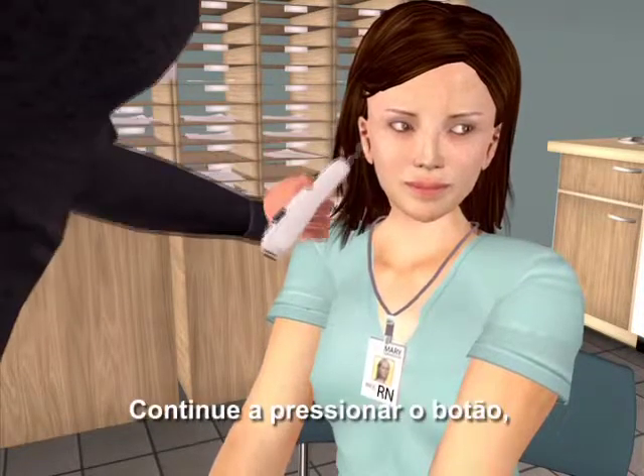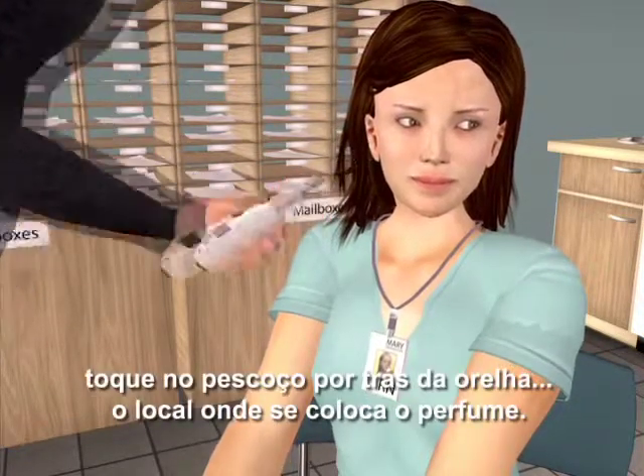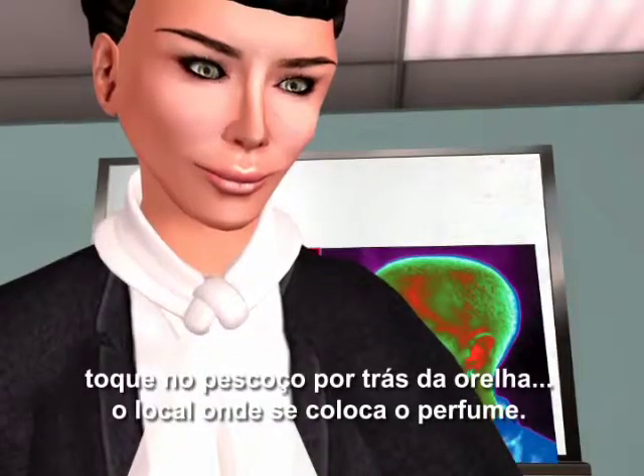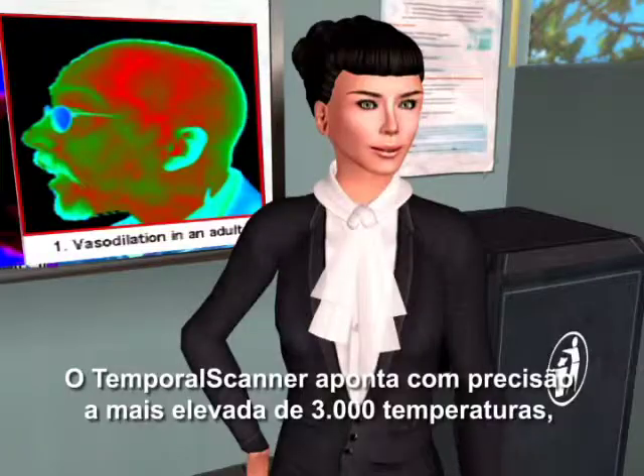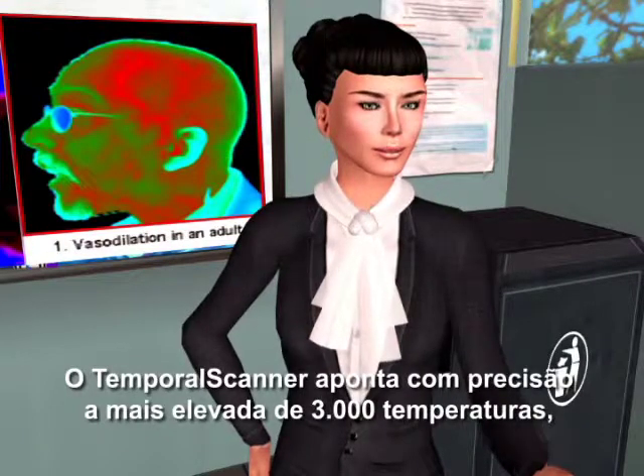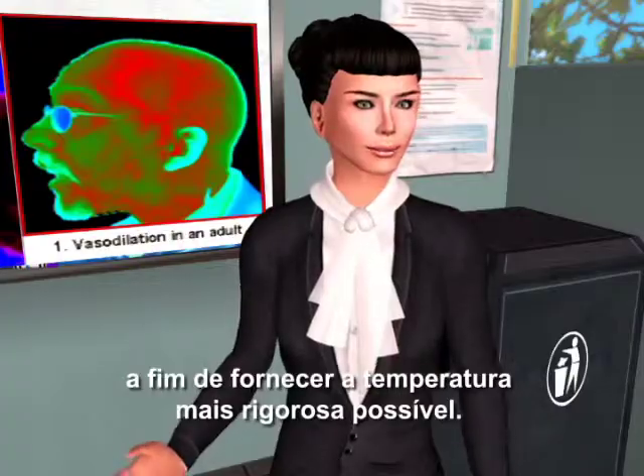Continue to hold the button down, touch the neck behind the earlobe — the perfume spot. Now you let go of the button and read the temperature. The temporal scanner pinpoints the highest of 3,000 temperatures to provide the most accurate temperature possible.